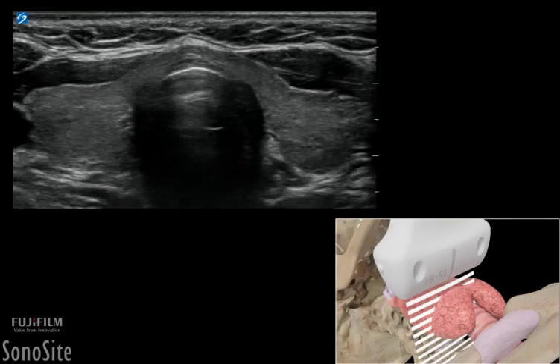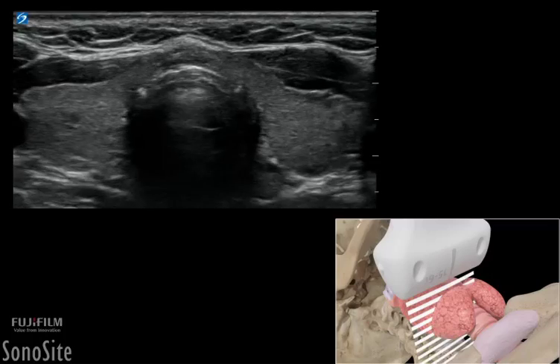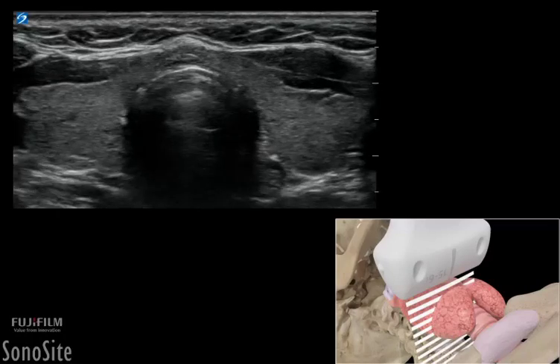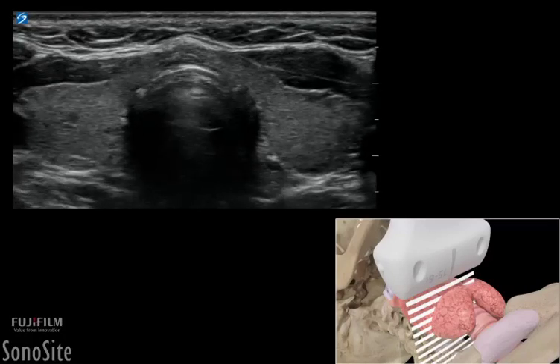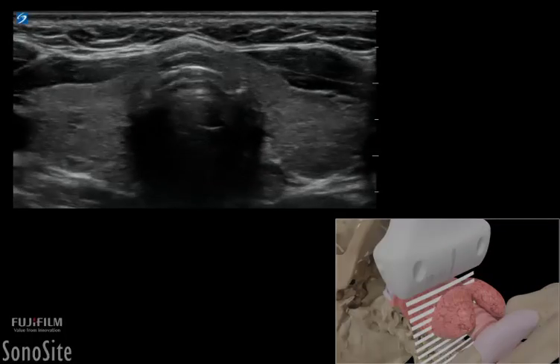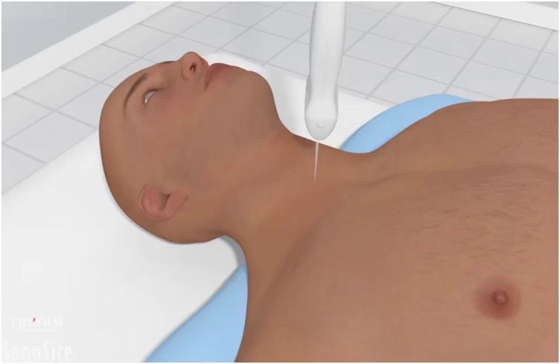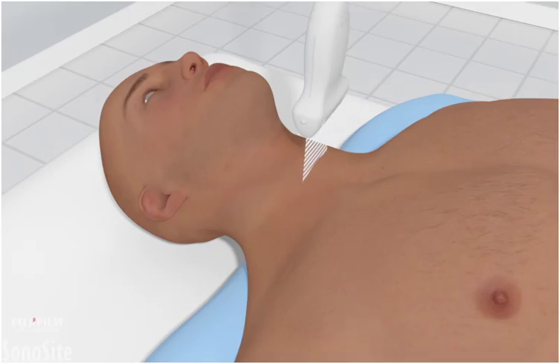A linear array transducer with a small parts exam type is used to perform an ultrasound examination of the thyroid gland. The patient is placed in a supine position with a pillow beneath the shoulders to extend the neck.